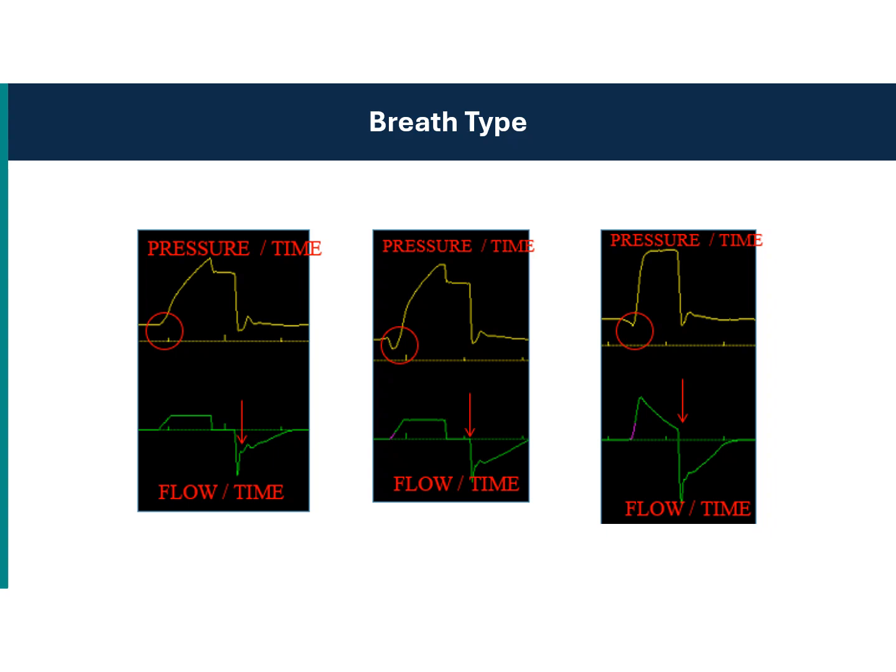You can also see there is a plateau here. This is because of the setting of inspiratory pause in the ventilator. Usually we do an inspiratory pause to assess the P plat and P peak. P peak you get once you put an inspiratory pause, and you can actually measure the P plat. P plat indicates the lung compliance. So basically, when you make the flow zero, the airway pressure will become zero. So total pressure is airway pressure plus lung compliance. What is the alveolar pressure? Once you make the airway pressure zero, what you're measuring is the alveolar pressure, which is nothing but P plat. We'll be discussing more about this.